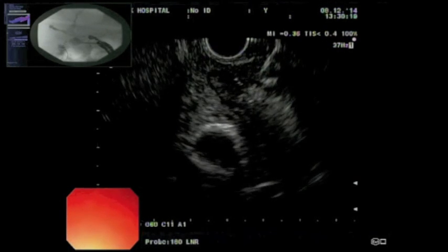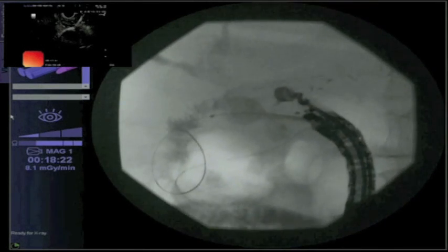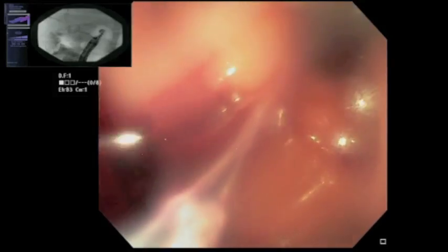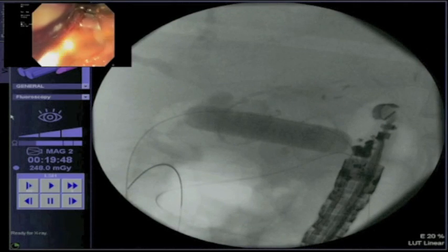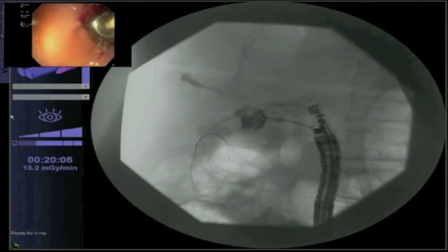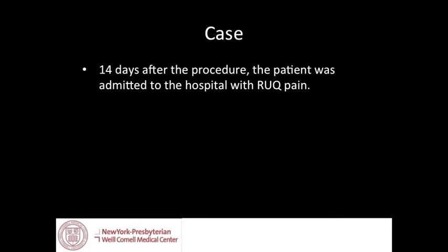loop, and the distal flange was deployed. The deployed flange was then pulled to juxtapose the choledochojejunostomy small bowel loop to the more proximal small bowel loop. The proximal flange was then deployed. A 15 mm CRE balloon was advanced over the guide wire and used to dilate the lumen of the stent. Contrast was injected post-deployment to confirm correct placement.